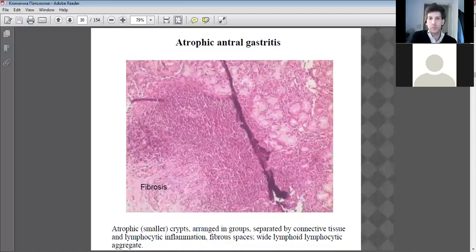But here's the example of the fibrotic tissue migrating into the area of inflammation. And notice this area is full of cell debris. See, all this area here is cell debris. So lots of white blood cells, lots of macrophages in there. The size of the lumens in these areas here are reduced as a consequence of this inflammation, so hence less ability to secrete enzymes and hydrochloric acid, for example, if this is occurring in the stomach.